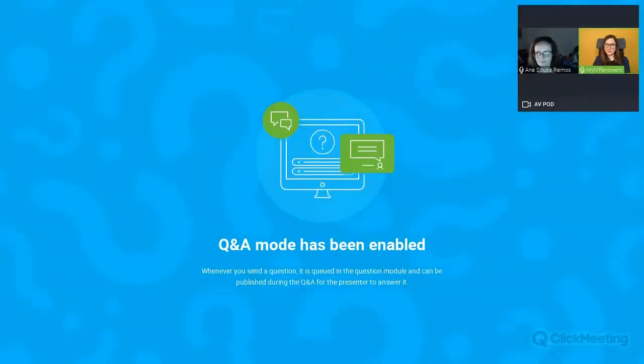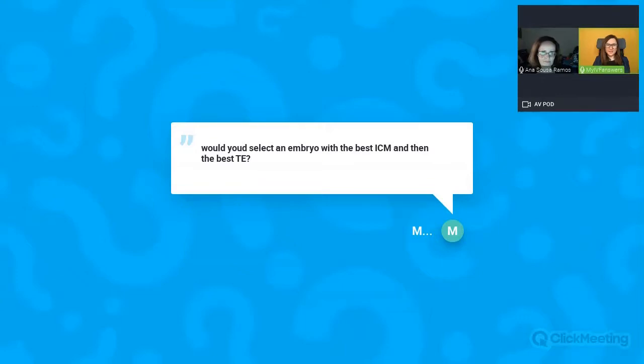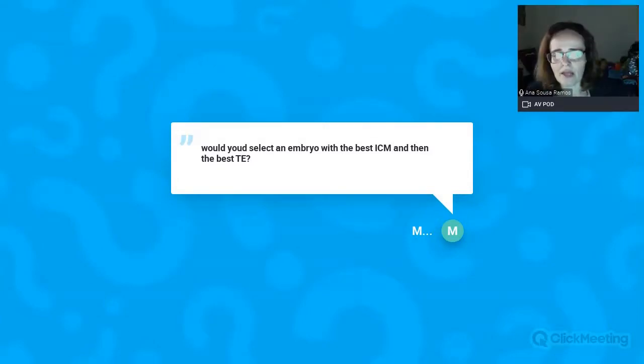So the first question is from Margie. Would you select an embryo with the best ICM and then the best TE? Okay, it's a very nice question. Usually, if you're comparing the ICM, the latest studies, it's funny, defend selecting the best trophectoderm first. So there are recent studies showing that when you have two blastocysts, one with a very good ICM and the other with a not so good ICM but a very good trophectoderm, you go with the trophectoderm, okay?